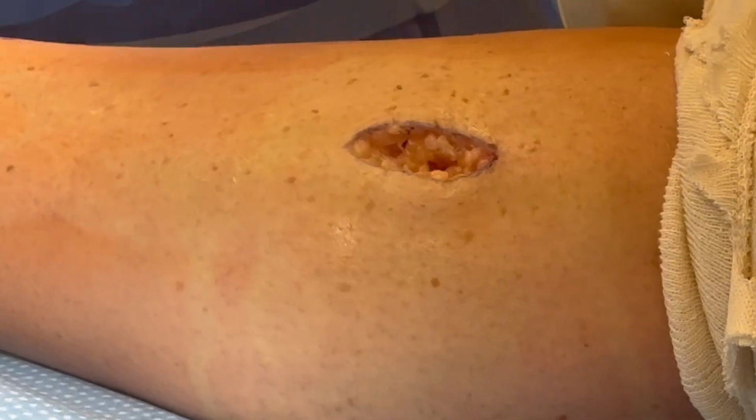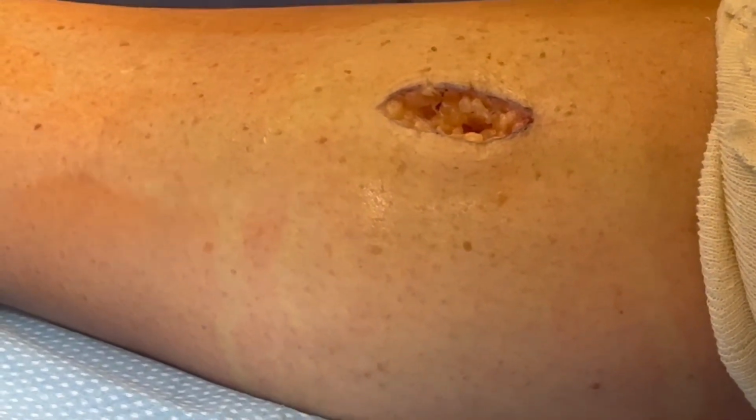And then from here, you can just go to your closure per your choice.